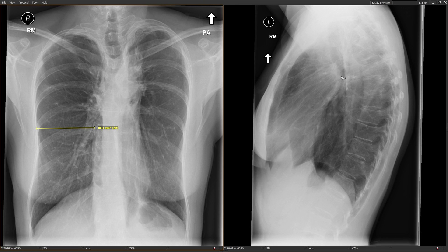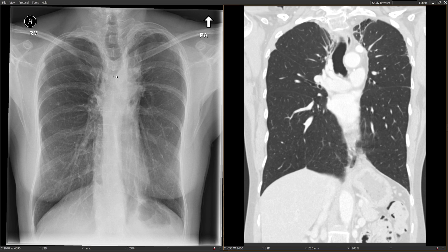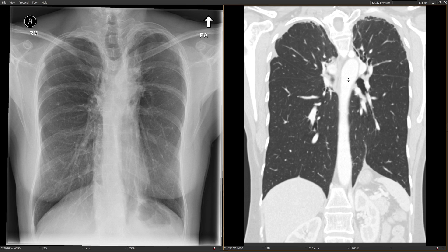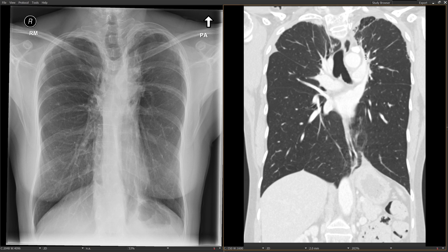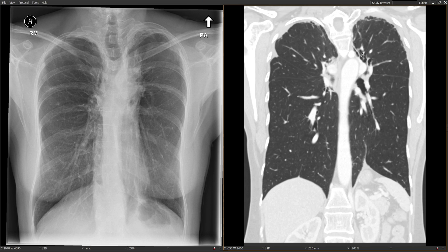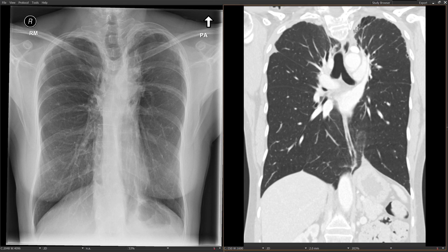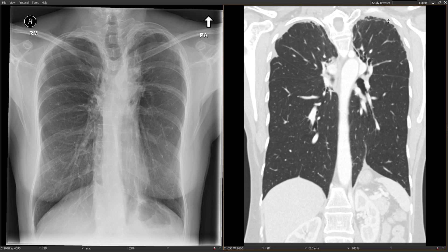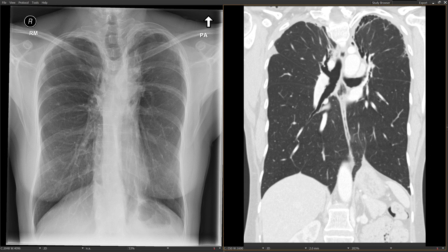Let's take a look at the CT on this patient. Here's the coronal CT — you can see that this is the minor fissure, which was what we were suspecting on the chest X-ray. It's too high and slanted, both signs of right upper lung fibrosis. You can see the radiation fibrosis in the perimediastinal portions of the upper lobes, which is why the upper lobes were fuzzy on the chest X-ray — fibrotic lung next to the mediastinum. The fibrosis also extends to the apices and along the lateral portions of the upper lungs, consistent with this person's history of mantle field radiation.